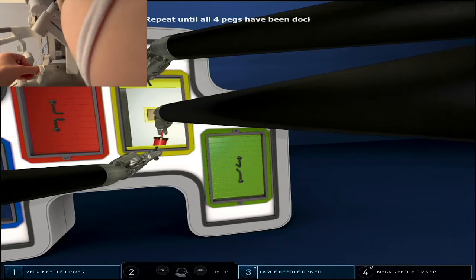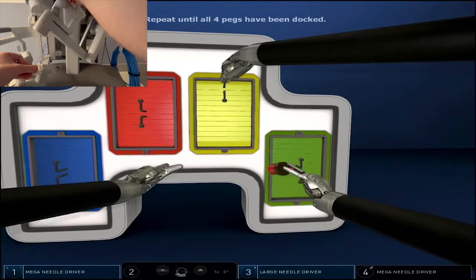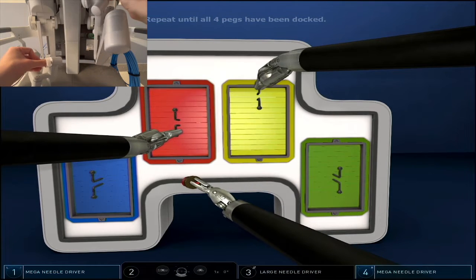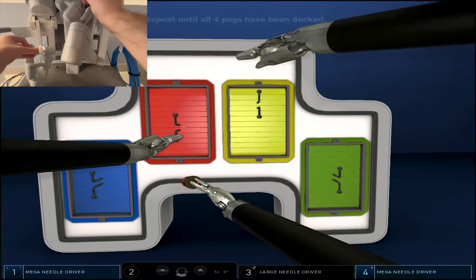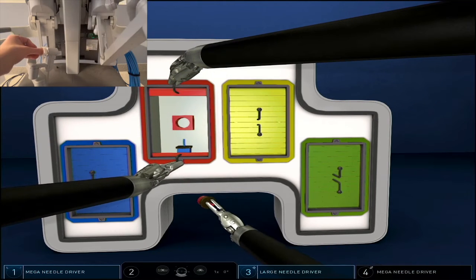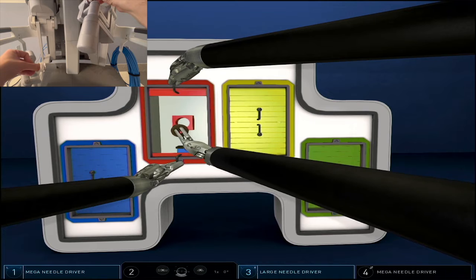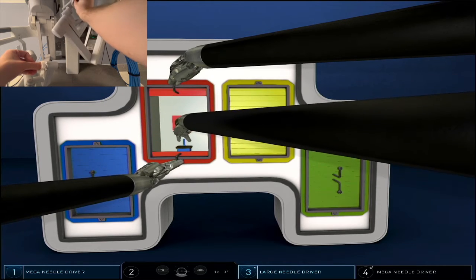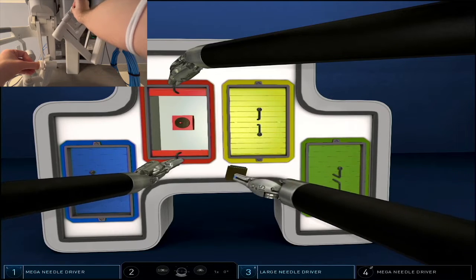However, try to maintain that as much as possible, even if it's not completely parallel. Besides that, the basics with every three arm relay exercise is you get a button on the left side of your left foot, which you can press with the lateral side of your foot, and this will allow you to exchange instruments instantaneously.